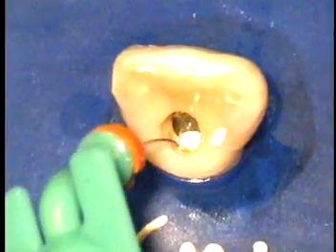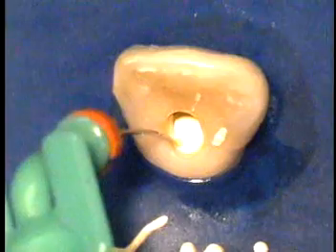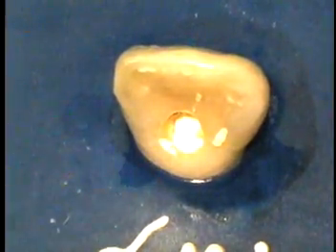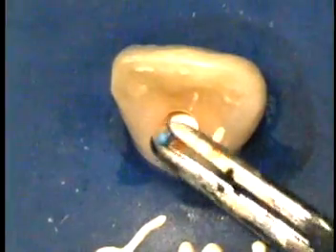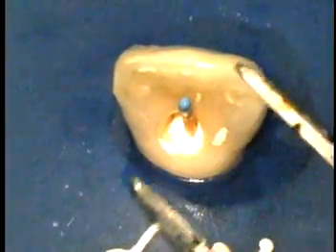Put the Navi tip 2 to 3 millimeters coronal of the apex, and begin to inject as you withdraw. If you hit a bind, back up from that bind before you begin injecting. Inject until you fill to the canal orifice, insert your gutta-percha point, burn it off with a very hot plugger or touch and heat, and then you can temporize or restore at this time.